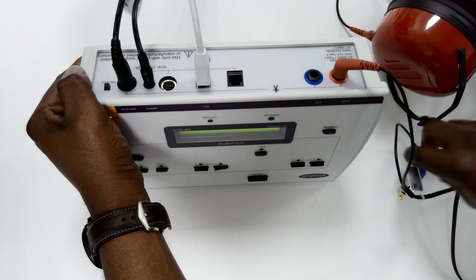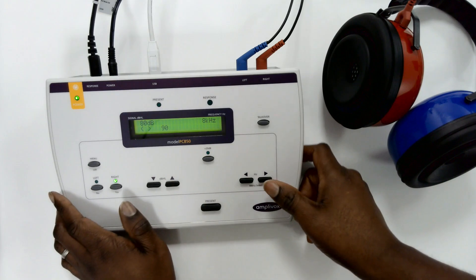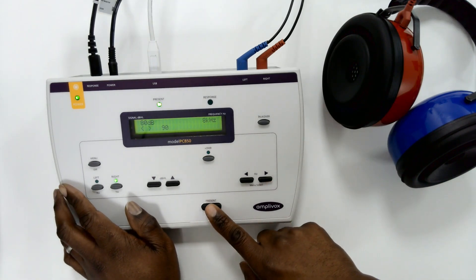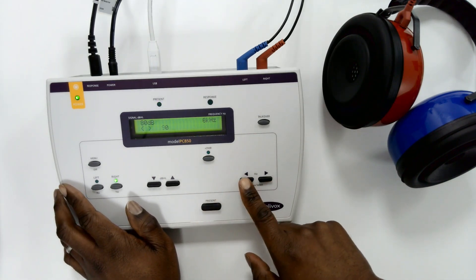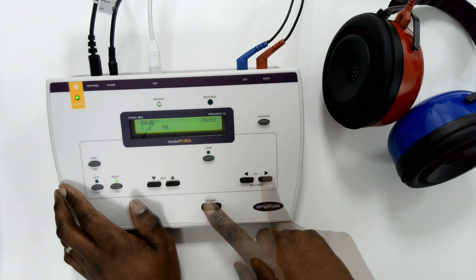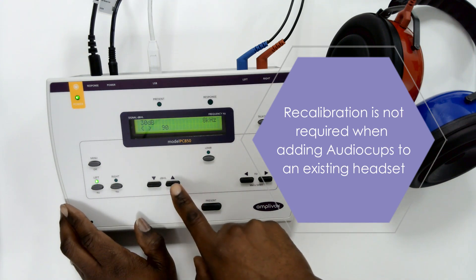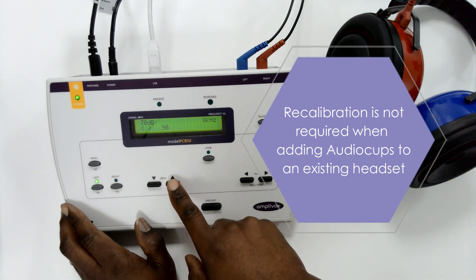Once completed, connect the headset to your audiometer and check that there is sufficient output. If there isn't, then retrace your steps to troubleshoot, ensuring all sufficient connections have been made. Calibration is not required when adding audio cups to an existing headset.